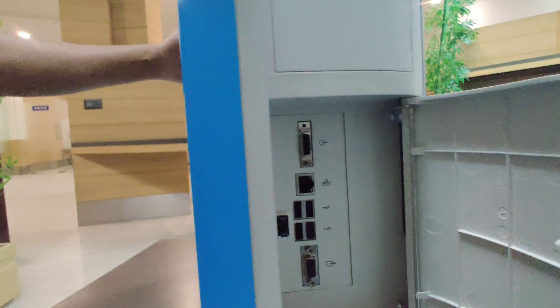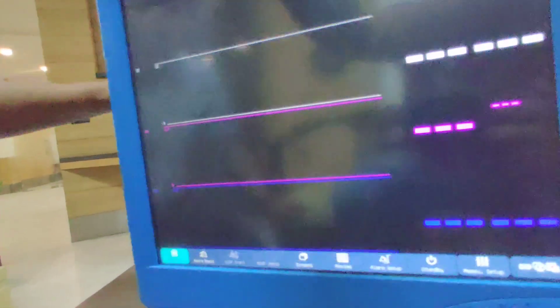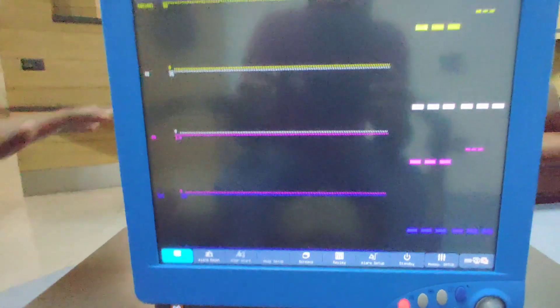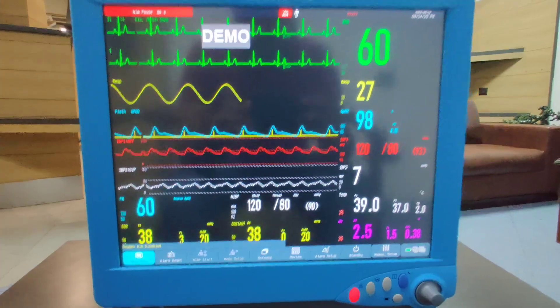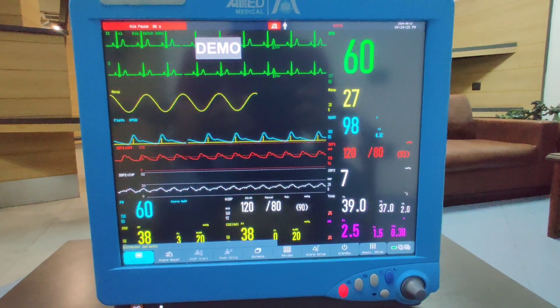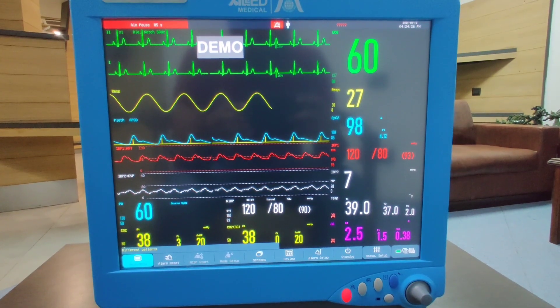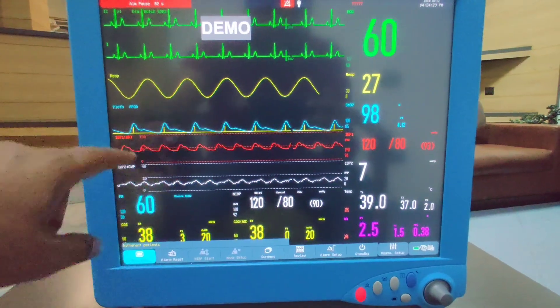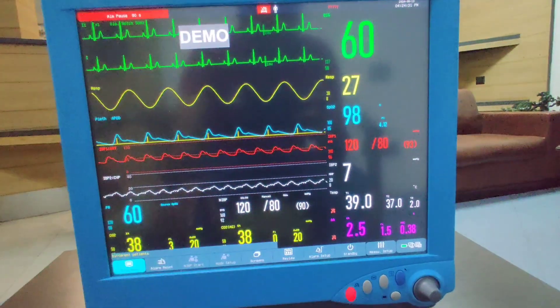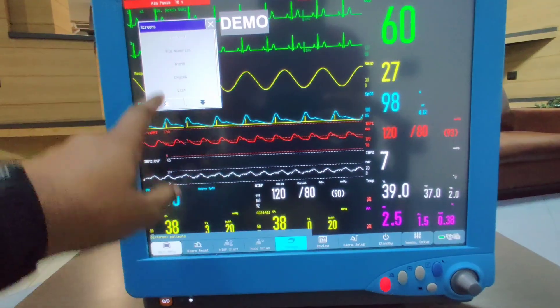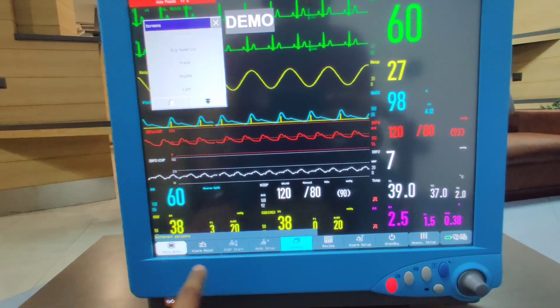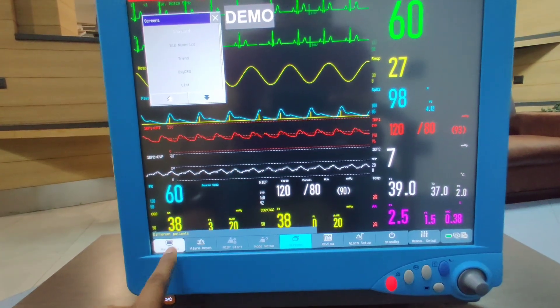The monitor right now is running on demo mode, so we are getting all the waveforms on the left side and these are the numerical values. If you want to change the layout of the screen, it can be done.